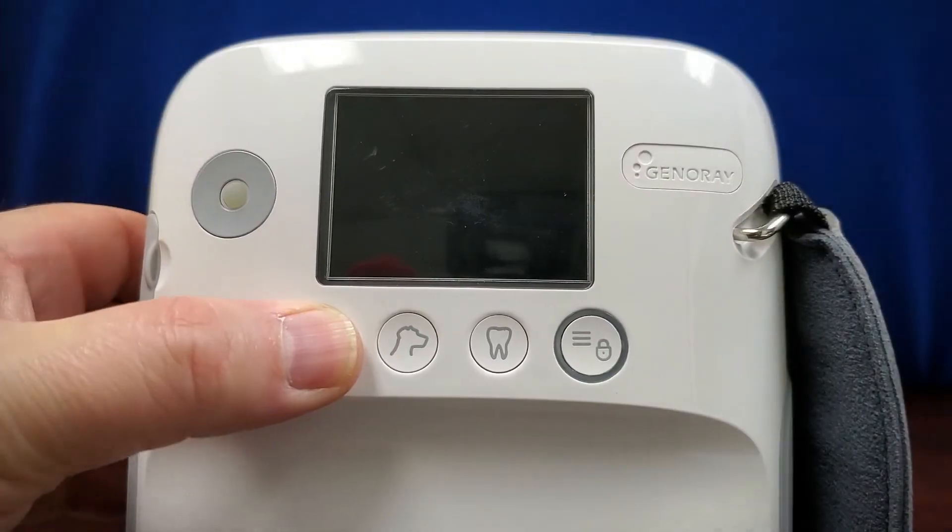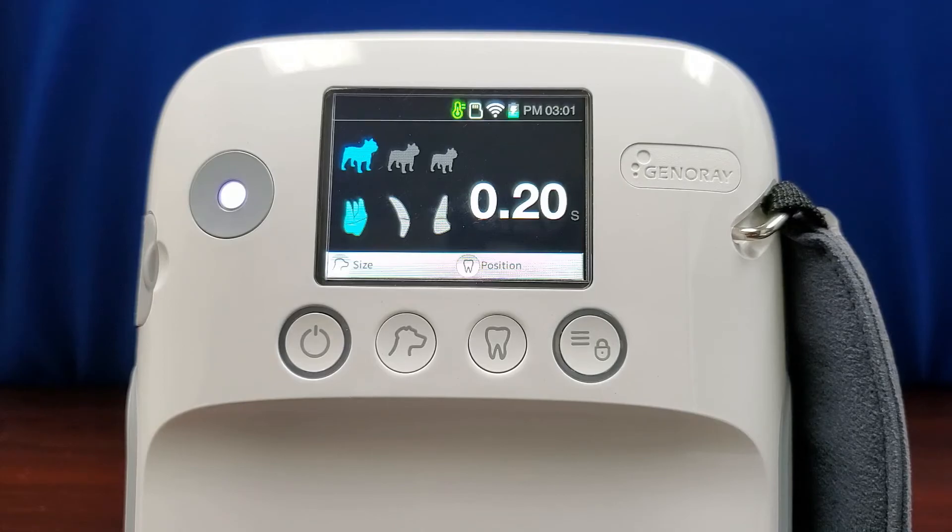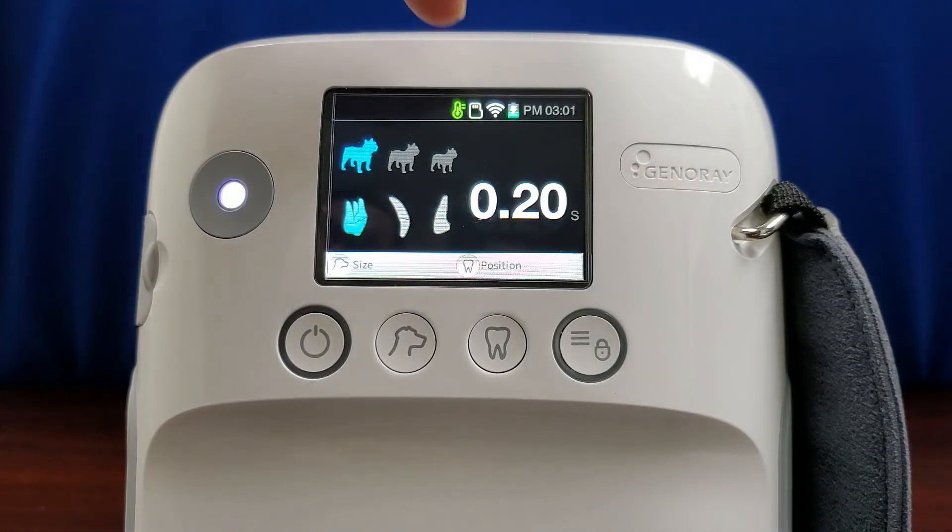Power on the unit by holding the button for at least 3 seconds. Once the unit powers on, you'll be brought to the main screen. Starting at the top of the screen, the first icon should be green to indicate a correct tube temperature. The next icon indicates the micro SD card is inserted in the unit.